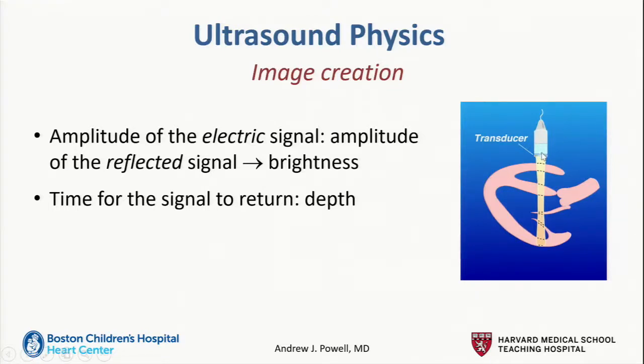So if you think about it, if it sends out a sound wave pulse and then stops and just listens, the signal that gets reflected back sooner is coming from the closer tissue to the transducer, the near field, and the sound waves that are coming back later are coming from the far field, or further away.